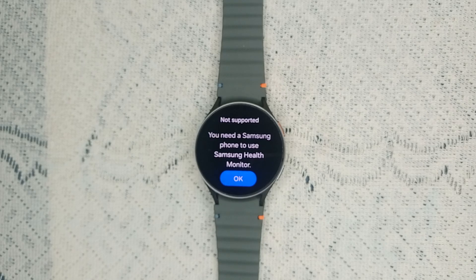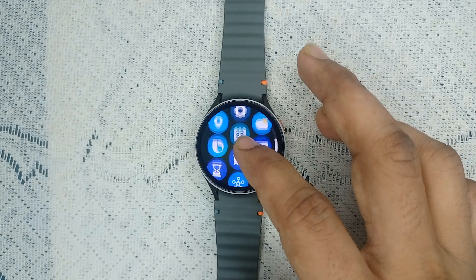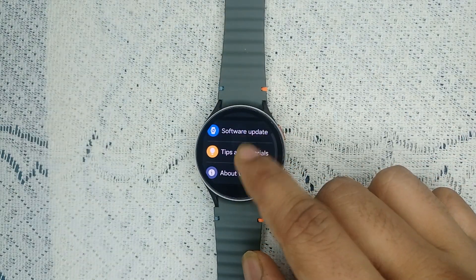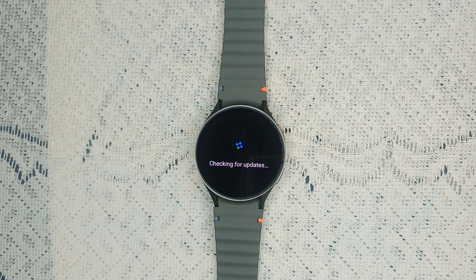The next step is to update software. Ensure both the watch and smartphone have the latest software update, as outdated software can lead to functional issues. Open the settings on your watch, go to Software Update, and click on Download and Install. It will take approximately two to three minutes. You can check whether your software is updated; if not, you will see a download button to install the latest version. Right now my watch is up to date.